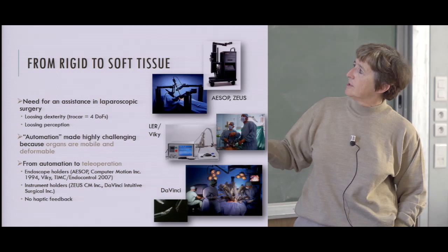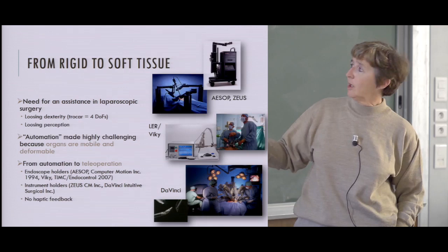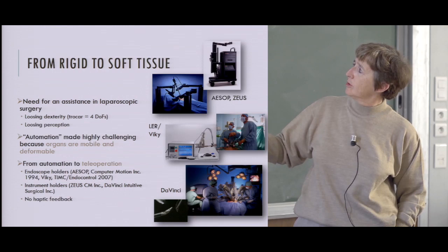The clinician operating the patient is here. He sees the inside of the patient through a 3D vision system, here, stereo vision. And he has some joystick which makes possible the control of the instrument which are on these robotic arms.